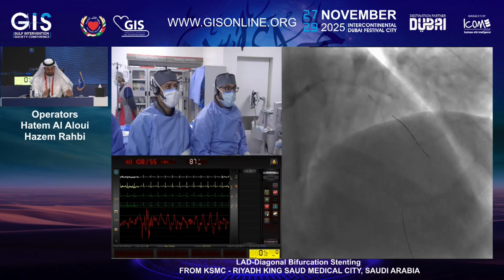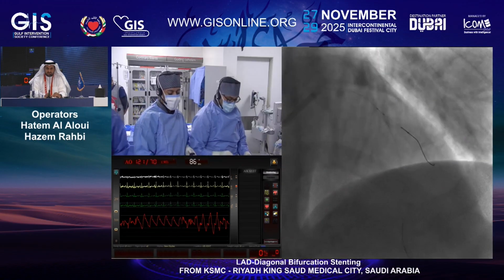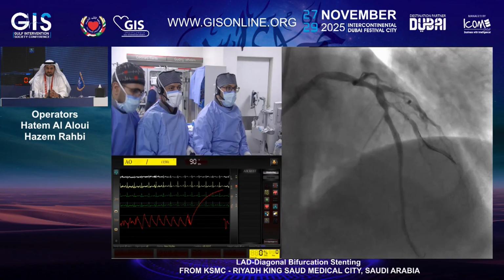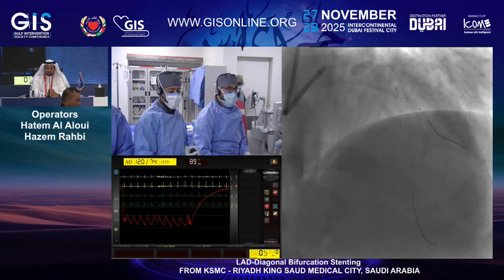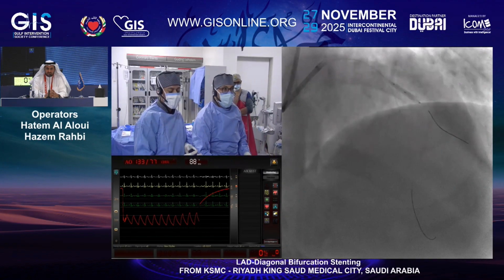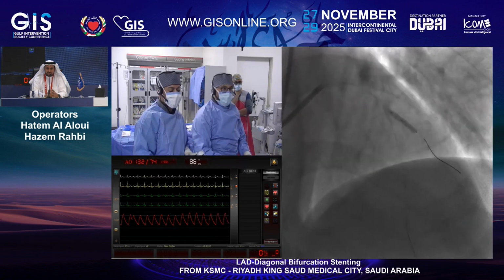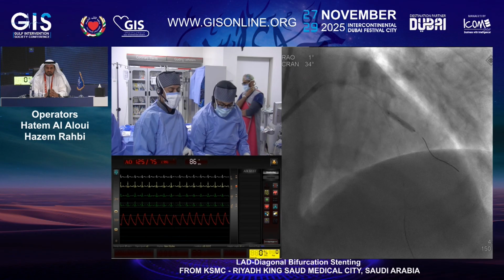So this is a cutting balloon now, 2.75 by 15. Small test, please. I will push my wire. Go up, please. Slowly. 6, 8. I think 2.75 by IVUS.